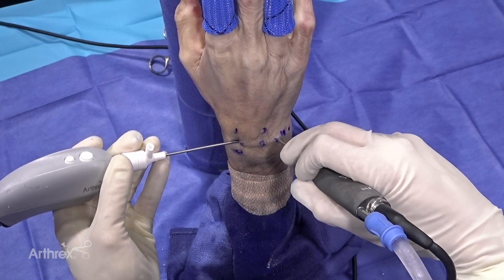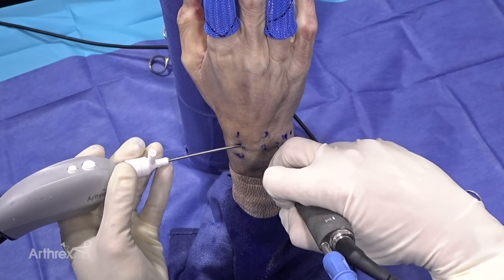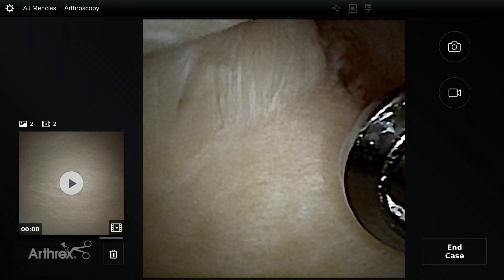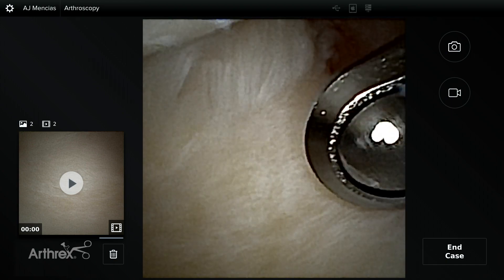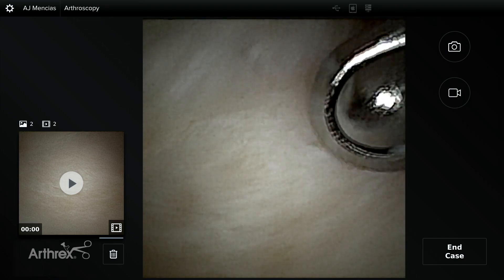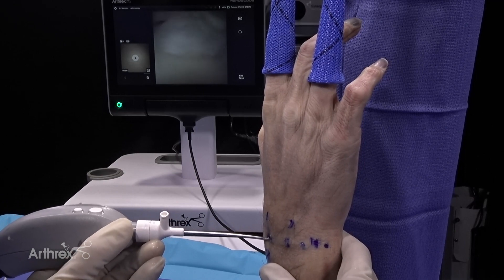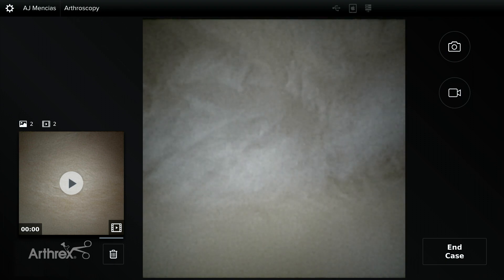One of the things that really hinders visualization in the ulnocarpal joint is synovitis on the backside. I'm looking at that synovitis and trimming it out really easily from a view you usually don't see, because this is a zero-degree scope. With a standard wrist arthroscope things are a little bigger. Also, these are disposable scopes and disposable peel packs, so your need for maintenance and repair will be much less. As we introduce the nanoscope into the radiocarpal joint you can see the volar synovium and get a hint of the radioscaphocapitate complex and the long and short radial lunate ligaments under this synovium.